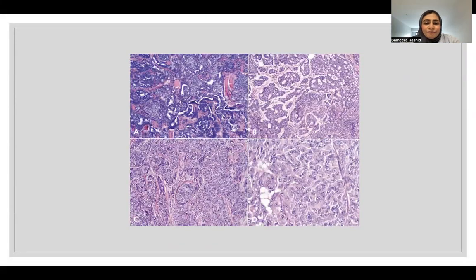Another important and extremely interesting entity. It's quite rare. This tumor has a diverse morphology. It can happen next to the fallopian tube, next to the ovary, but at other sites closer to the female genital tract as well. It has a very diverse morphological spectrum. It can form tubules, nests, or gland-like structures. What is astonishing about this tumor is that though it is closely related to the female genital tract, it is negative for the female genital tract markers.